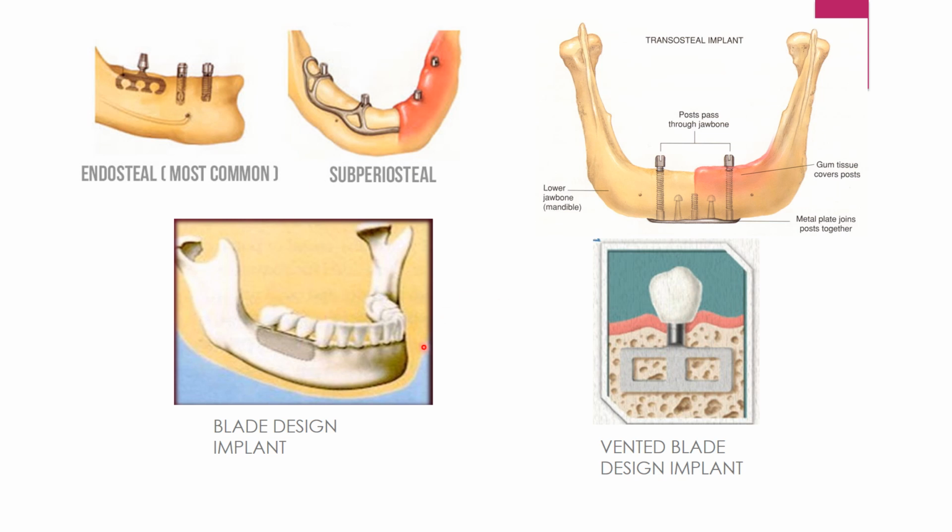Examples of the vented design. So these are the blade designs, and this is the vented blade design. So you can see that there are two holes for better connection.